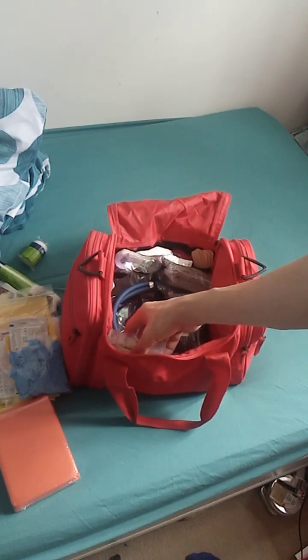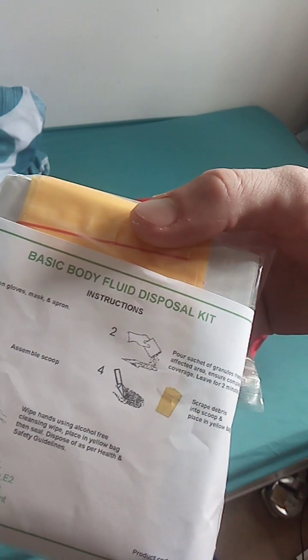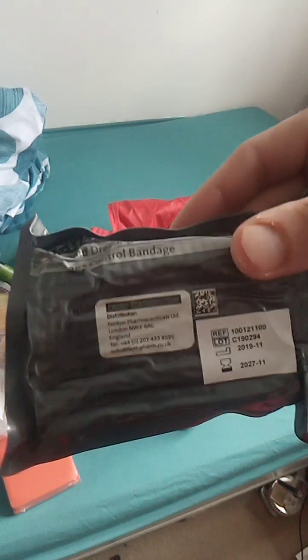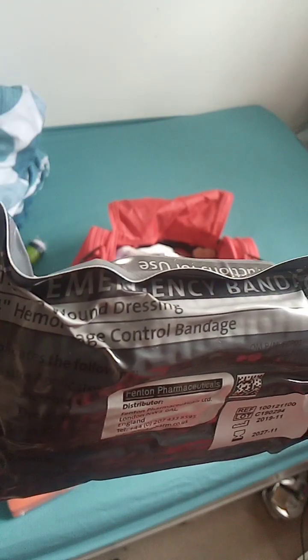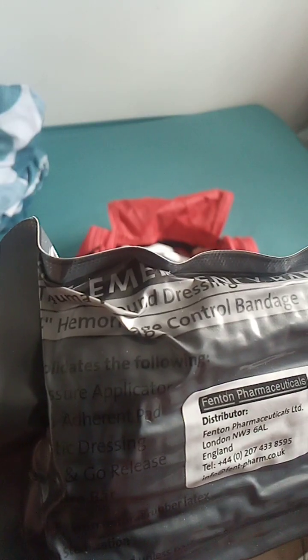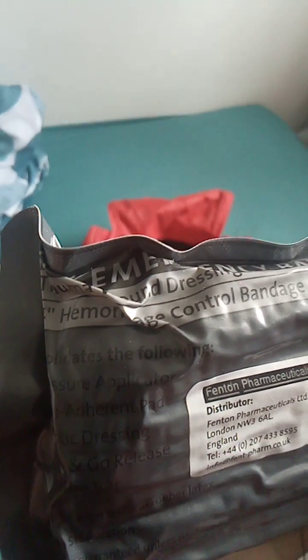Sam's splint, in case someone has a suspected broken or fractured arm or ankle, stuff like that. Body fluid disposable kit - all in one. You get body spill granules and an apron and a shovel and stuff. These are called blood control bandage, also known as an Israeli bandage - vacuum packed with instructions. Hemorrhage control bandage as well.